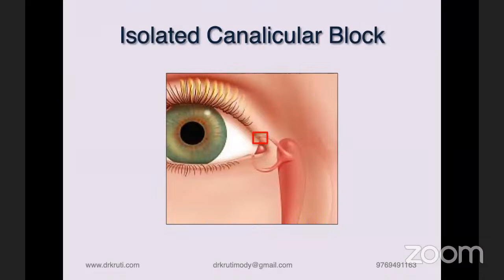Canalicular block. Now, management of canalicular block is a topic of discussion. Not all surgeons are very favorable towards it. The point is, you have either a proximal, a mid, or a distal canalicular block. How are you evaluating a canalicular block? You are passing your probe and seeing how far it goes.